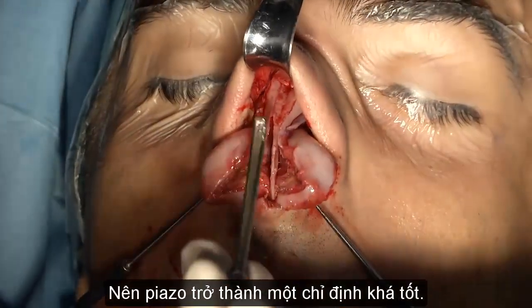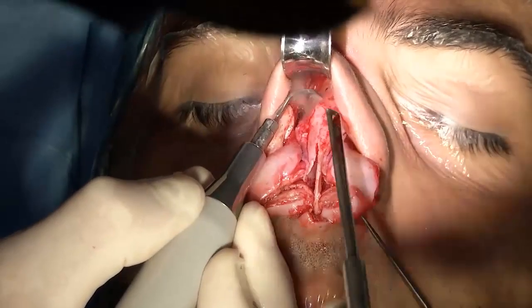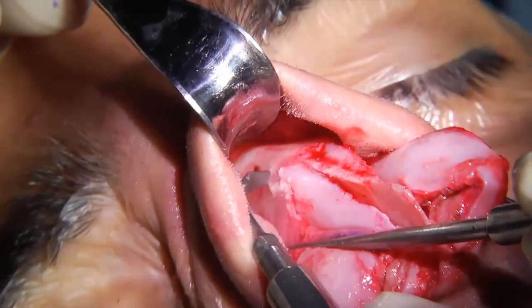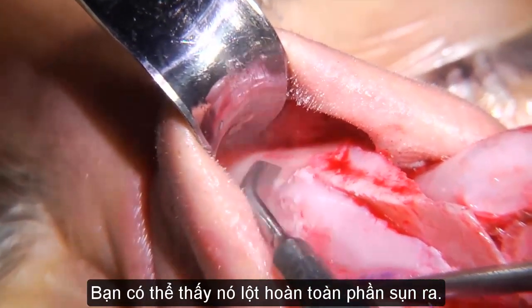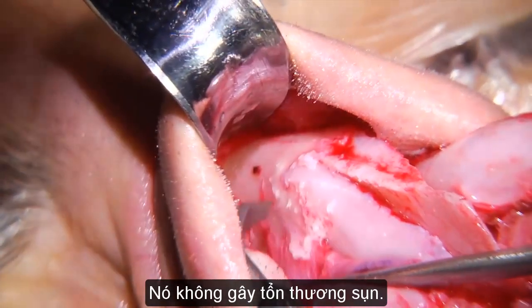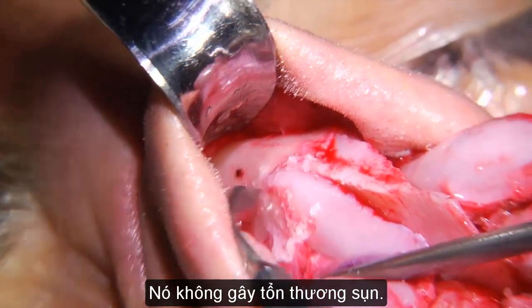So piezo here becomes a good indication, since you obviously see it spares the cartilage completely. It's not injuring it.